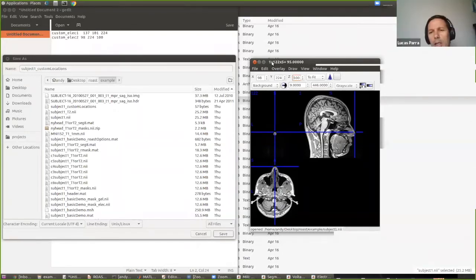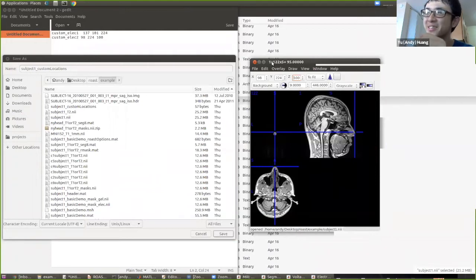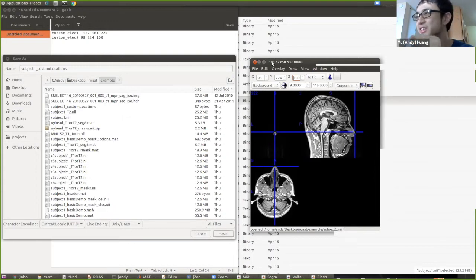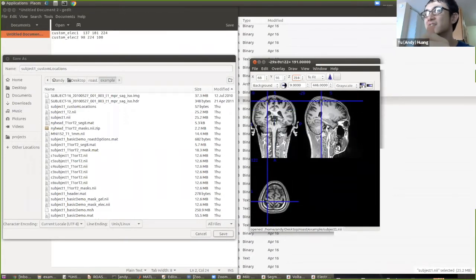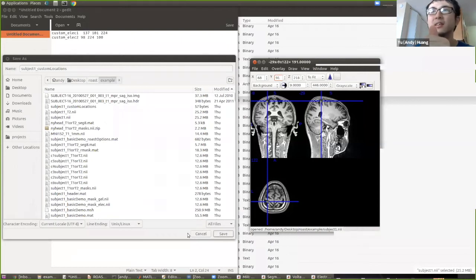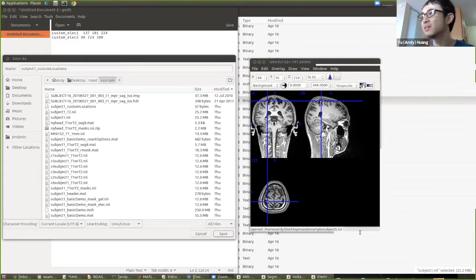On intracerebral stimulation — placing electrodes inside the head — theoretically it's possible. I haven't tried it myself, and the boundary condition for the finite element solver is tricky. But you could try clicking on the cortex, recording the voxel coordinates, and seeing what happens. Electrode size configuration is coming up shortly.